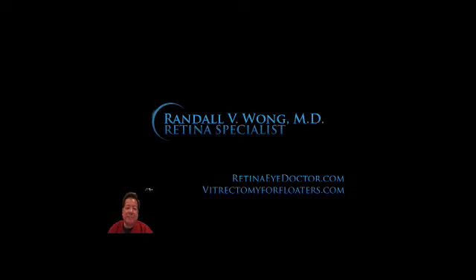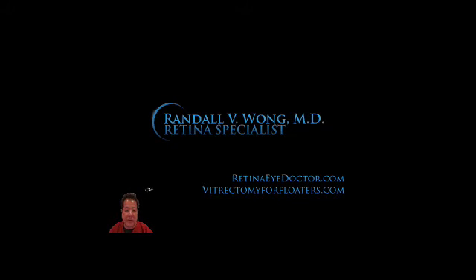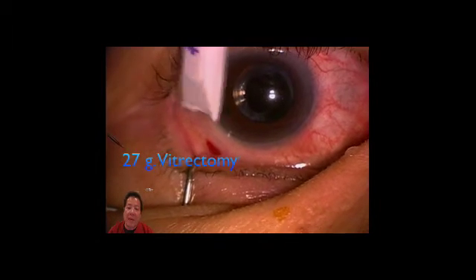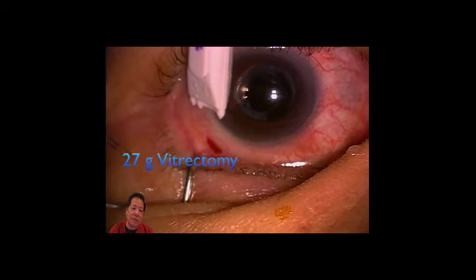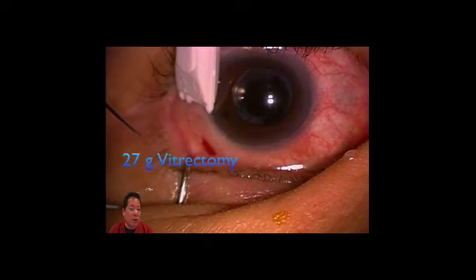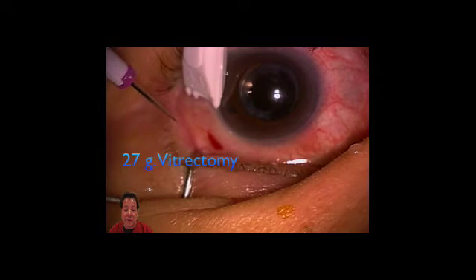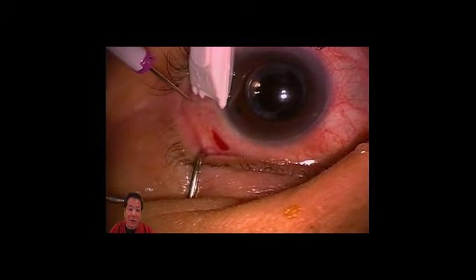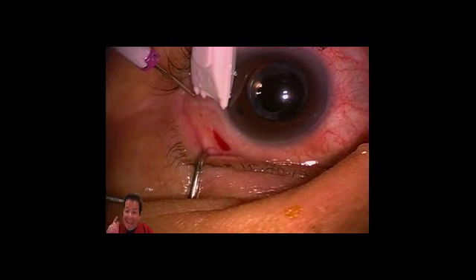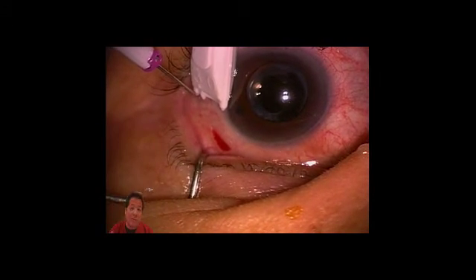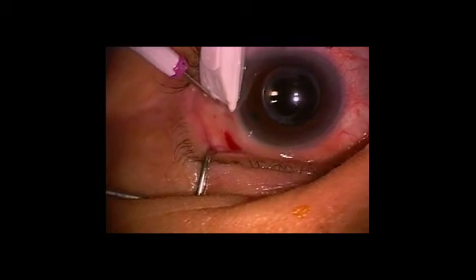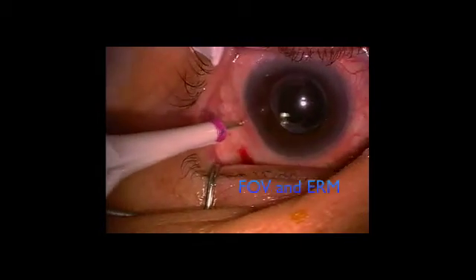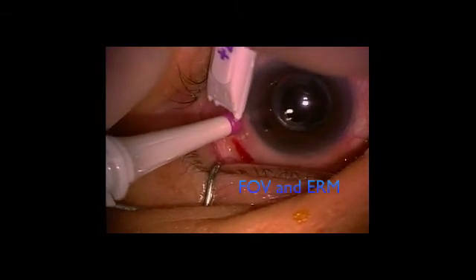Hi, I'm Randy Wong. I'm a retina specialist located in Fairfax, Virginia, and this is one of my very first 27-gauge vitrectomies. I'm going to perform this vitrectomy to remove vitreous floaters, otherwise known as FOV, and to remove an epiretinal membrane. So I'm doing one operation to achieve two goals.